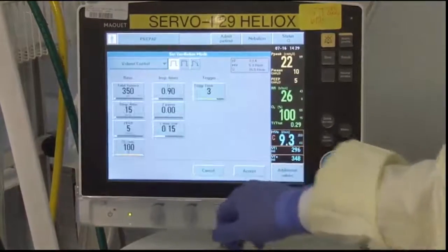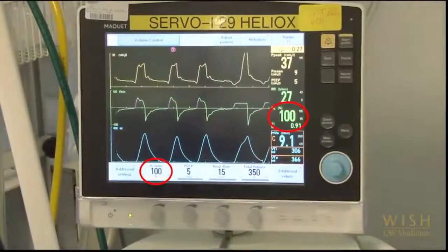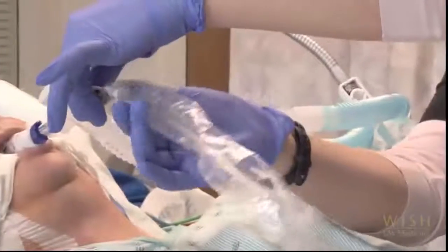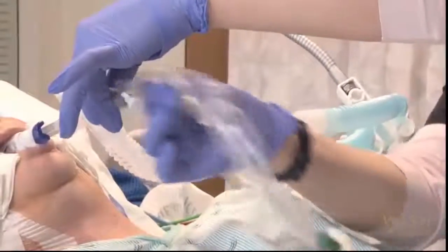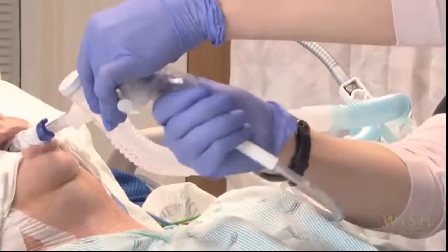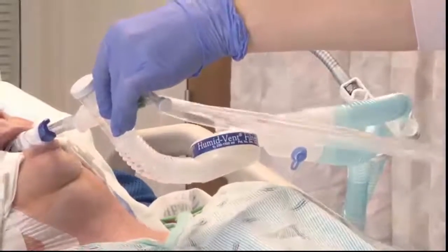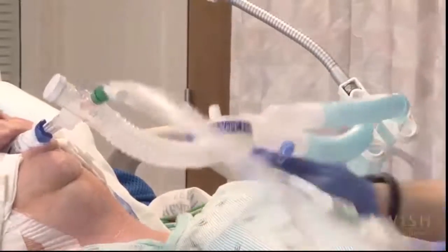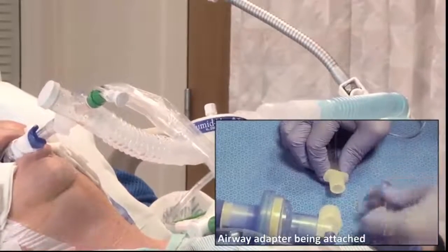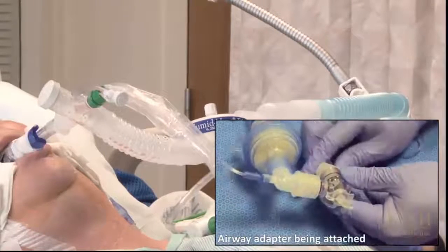Prior to actually performing bronchoscopy, one should pre-oxygenate the patient with 100% oxygen and order and administer pre-procedural sedation and analgesia. It is frequently useful in intubated patients to first perform inline endotracheal suctioning to clear any accumulated secretions in the upper airway and the endotracheal tube. This maneuver is also a useful test to determine if the patient should be preemptively given more sedation. In this example, 1 to 2 milliliters of 2% lidocaine can be administered via the endotracheal tube before the bronchoscopy adapter is attached to dampen this patient's airway sensitivity.